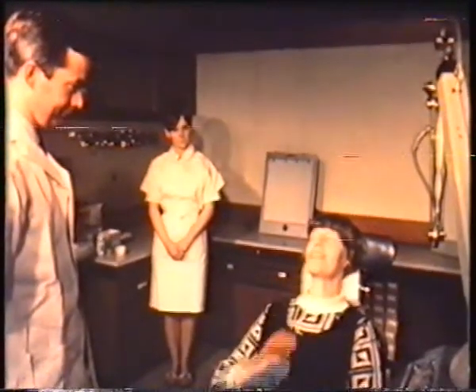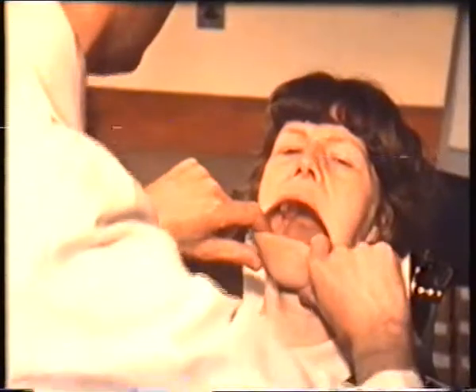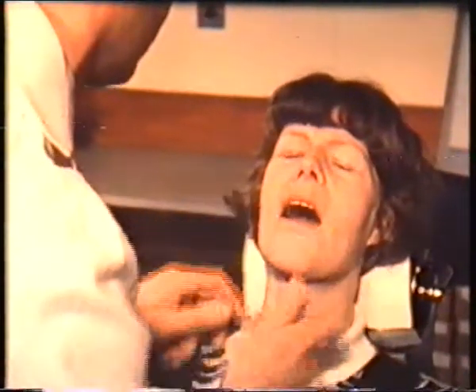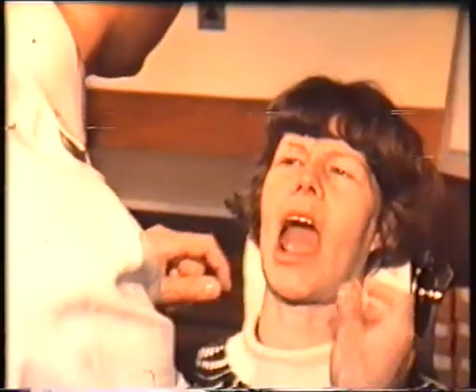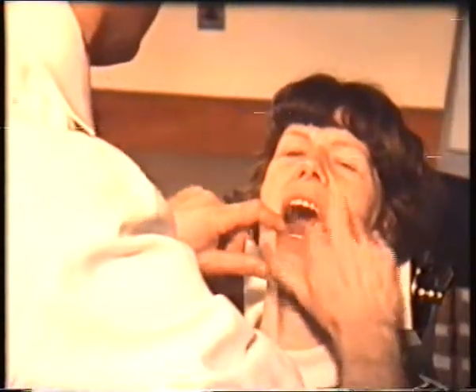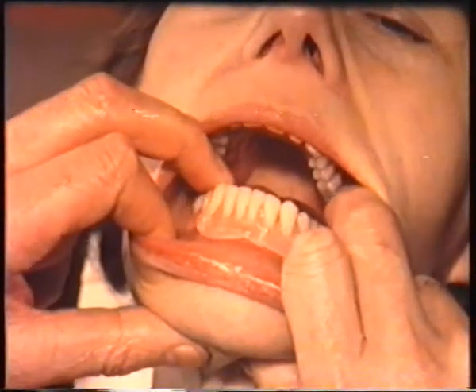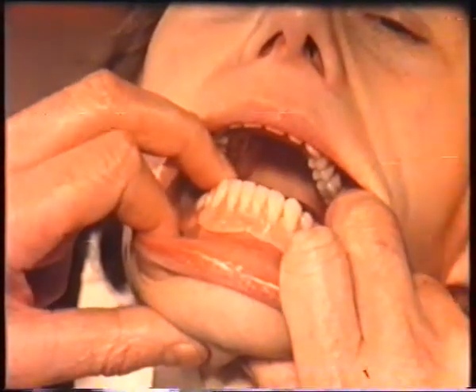After 6 weeks, Mrs. Dixon reports that although the upper denture continues to be satisfactory, the lower denture has become progressively looser. It is quite common to find that this has occurred to a greater extent in the lower than in the upper jaw. Inspection shows that there has been quite marked resorption of the anterior part of the lower alveolar ridge, and the denture is consequently unstable.